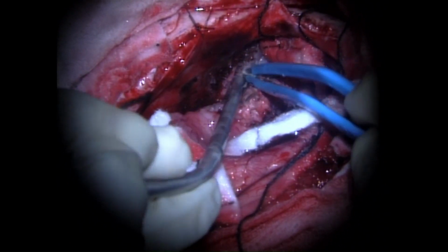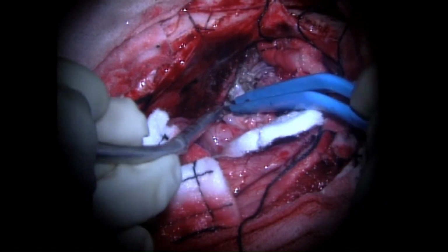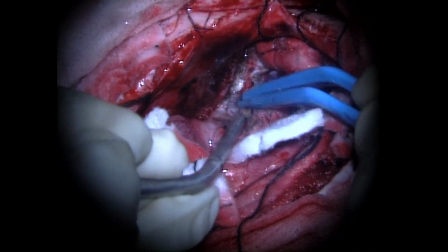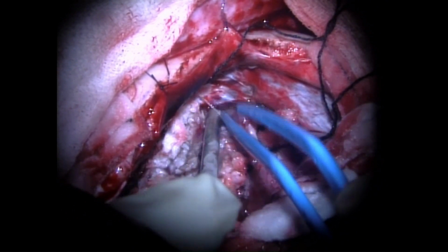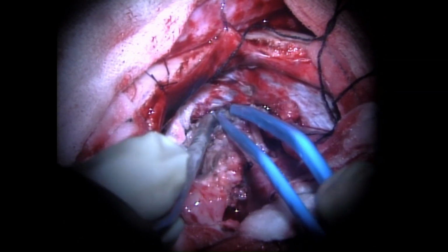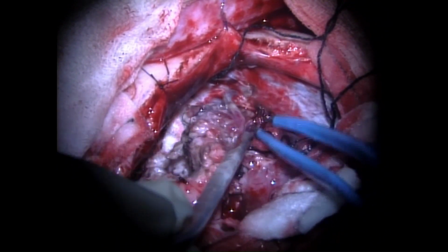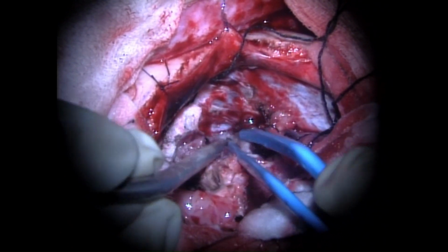Here you can see I'm using a bipolar coagulation forceps to devascularize the tumor, as it was seen to obtain blood supply at the skull base from the dura, and a combination of coagulation and sharp cutting is used to devascularize this tumor. Here you can see the tumor being gently pulled by the use of coagulation and suction from its attachment to the falx cerebri. The tumor is seen to be extending under the free margin of the falx cerebri to the contralateral side.